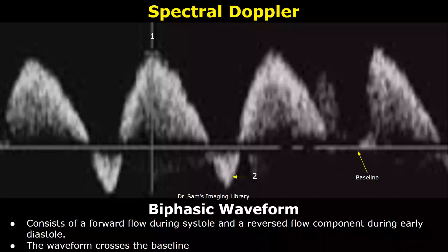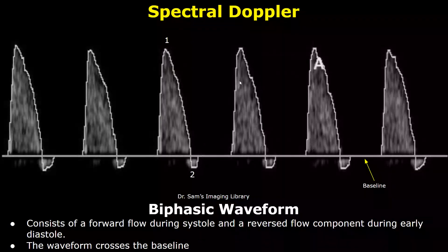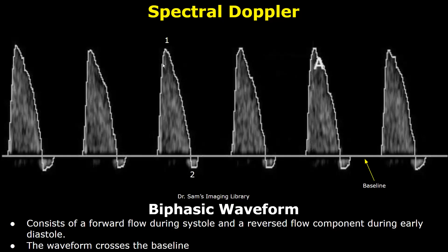In this waveform we see two components: one is of forward flow and the other component is reverse flow during early diastole. Two prominent components are seen, so it is a biphasic waveform. The waveform has crossed the baseline. Here is another biphasic waveform — we have a large forward component and a small reverse flow component, so two components are present, therefore it is a biphasic waveform.